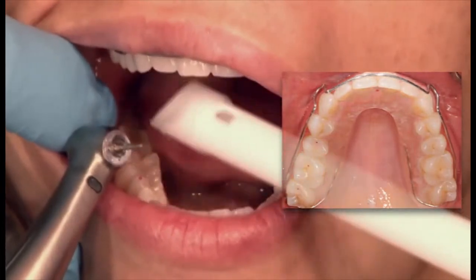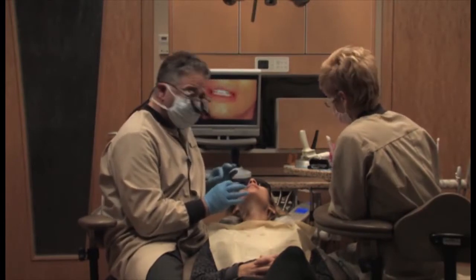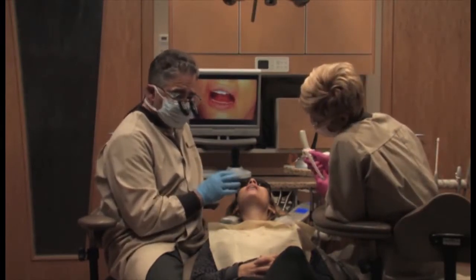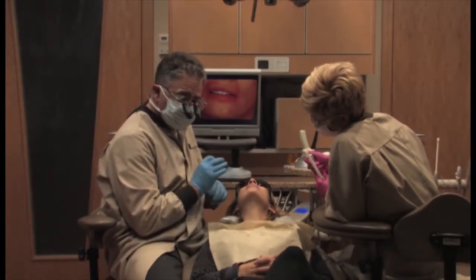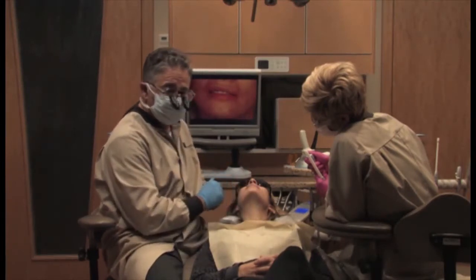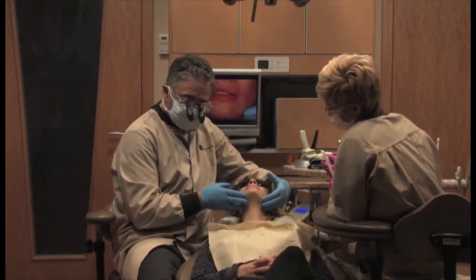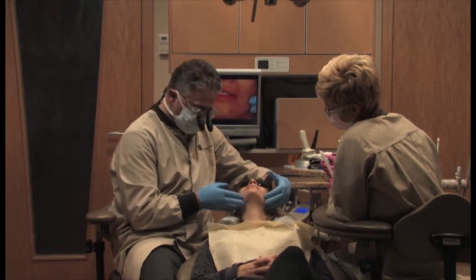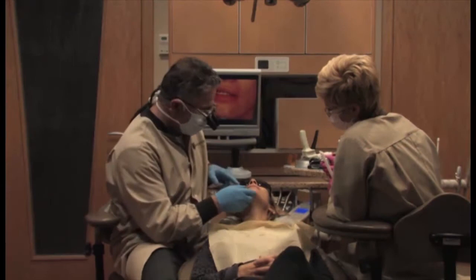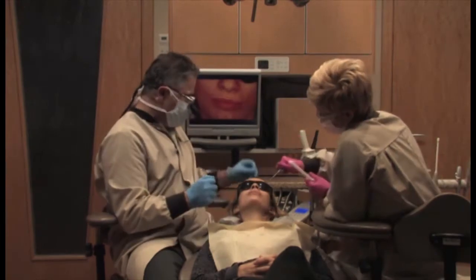So I use the fine diamond, I deepen the fossa, and at this point, it should have no contact on the posterior teeth at all. In other words, I continue to remove contacts until the contact comes back onto the deprogrammer on the front. In that way, I'm stabilizing the jaw, so the jaw is not deflecting from any inclines or any posterior teeth until I get more of them to start to touch. At this point in time, do you have any contact on the back? No. No. So now I can come back to the deprogrammer.